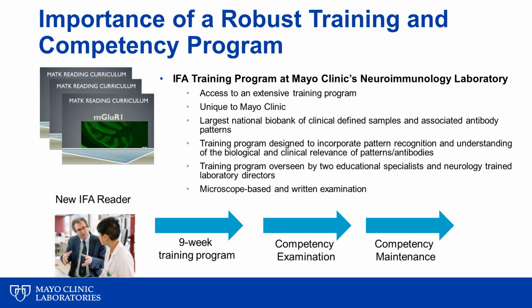The training program itself utilizes a biobank of clinically defined specimens that are used to train staff, first in an unblinded fashion, and then subsequently in a blinded fashion. The program includes written and microscope-based work. After this intensive 9-week program of training, there's a blinded competency examination.